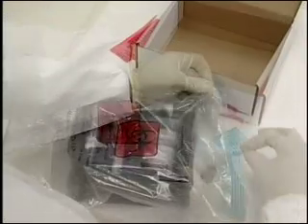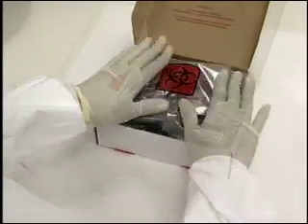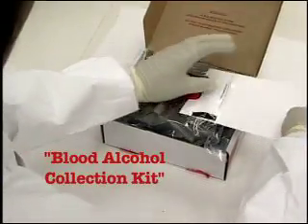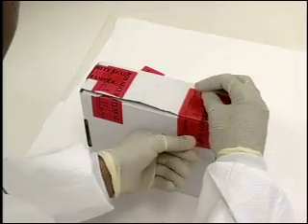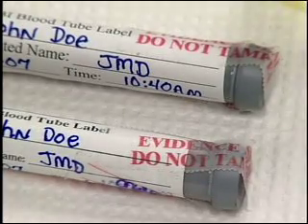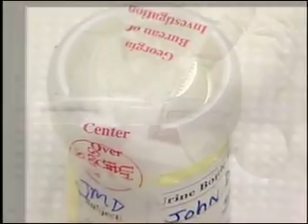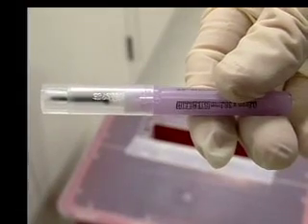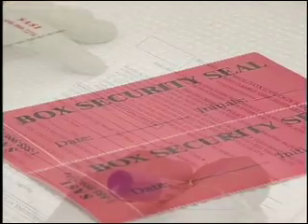In suspected DUI cases, blood and/or urine can be submitted for testing. Specimens are submitted in a GBI-approved blood alcohol collection kit. These kits include all the items necessary for proper specimen collection: 2 gray stoppered test tubes, a leak-proof plastic screw-capped urine container, betadine swab, needle, labels, security seals, evidence tape, and a submission form.